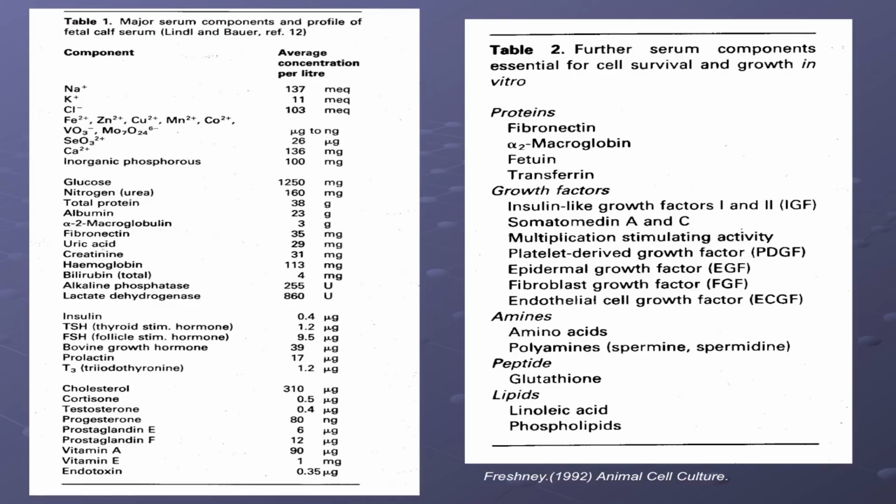We have to know about media and serum. Varieties of commercially available media are there. We can get them from HiMedia, and many companies provide these. The commercially available media has to be prepared perfectly in the respective laboratories. Then there are the sera, which are also commercially available from many companies like Serotech, Gibco, or HiMedia. Those companies commercially provide these varieties of serums.